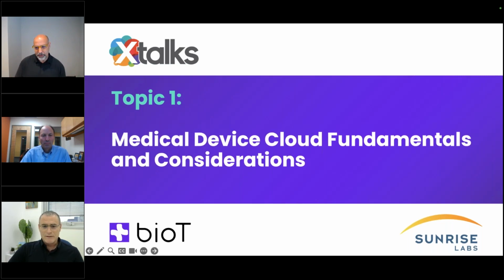First of all, hi everyone, John, Adam, and great having you here. Before talking about what a cloud-powered medical device is, I'll explain the difference between a connected device and a cloud-powered medical device. When talking about connected devices, we are talking about basic functions such as transmitting device and patient data from a device in a secured manner, mainly towards third-party systems like remote patient monitoring tools or EHRs.